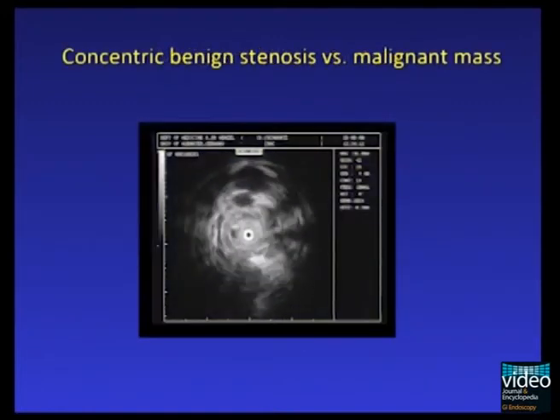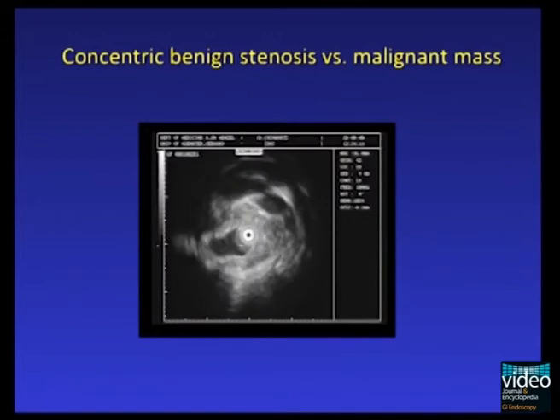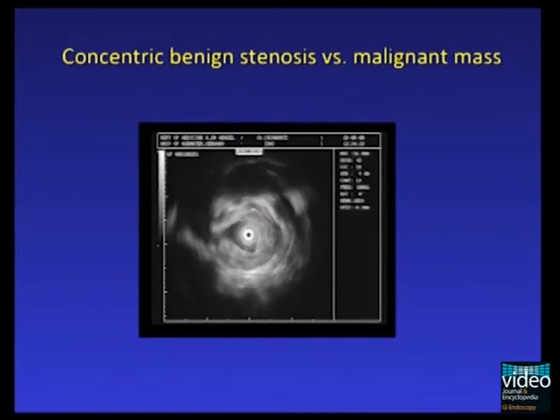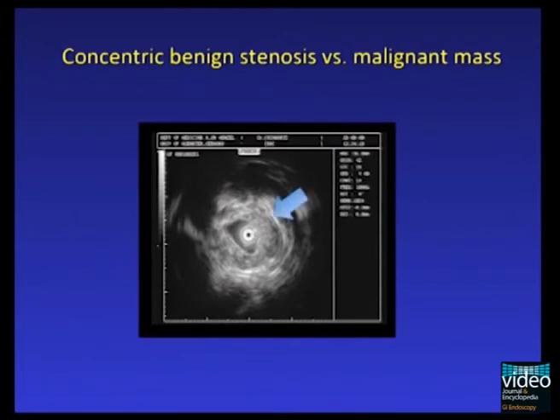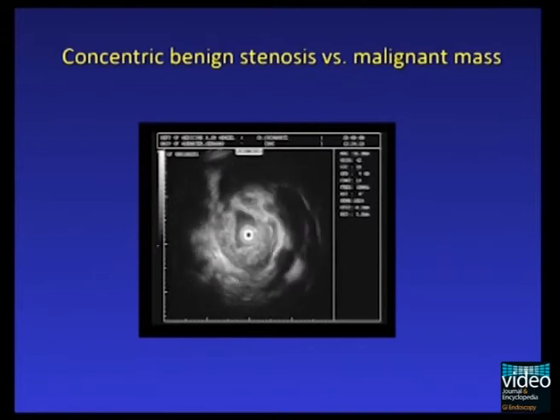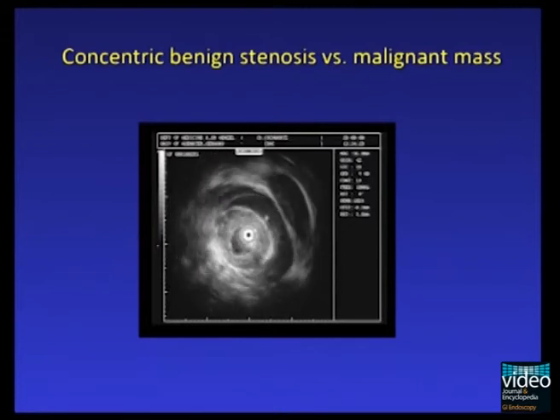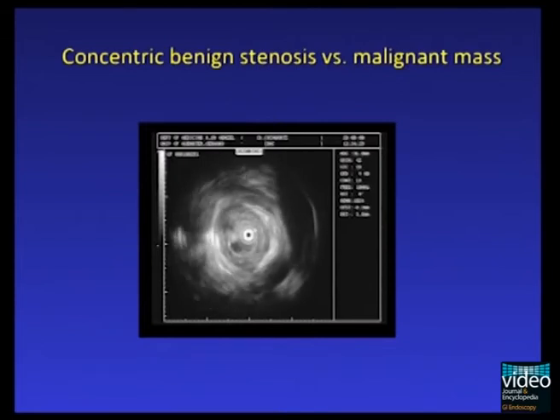Sometimes it may be difficult to judge the biliary wall after previous insertion of a plastic stent. As seen in this video sequence, the biliary wall is thickened in a concentric fashion. After further cautious withdrawal of the EUS probe, we recognize the true pathologic finding: an echo-poor, echo-inhomogeneous mass.